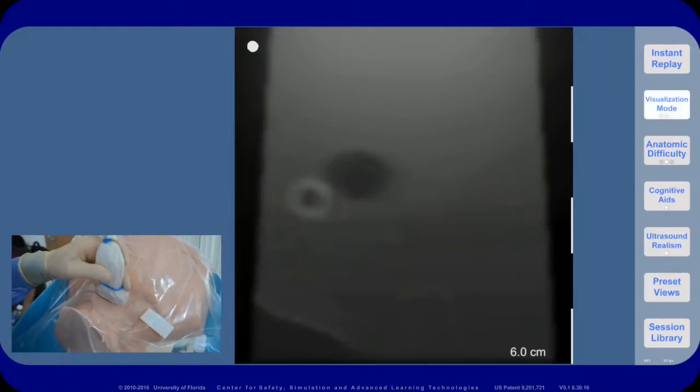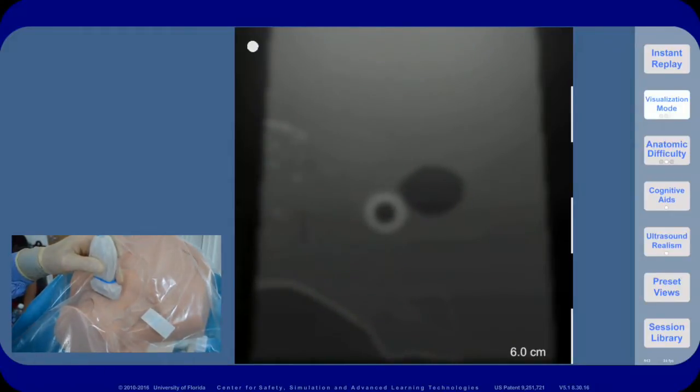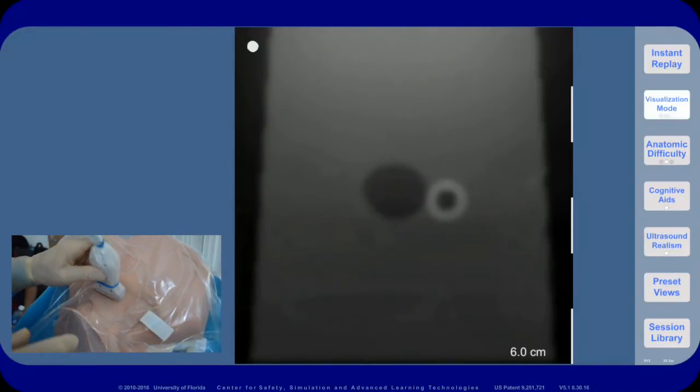Sliding the ultrasound probe to the left and right is helpful in making sure that you have your left and right sides properly oriented. The vein is a useful landmark when you are checking for the proper orientation. It is important to check for proper orientation because if your ultrasound probe is turned 180 degrees, your image would be backwards.